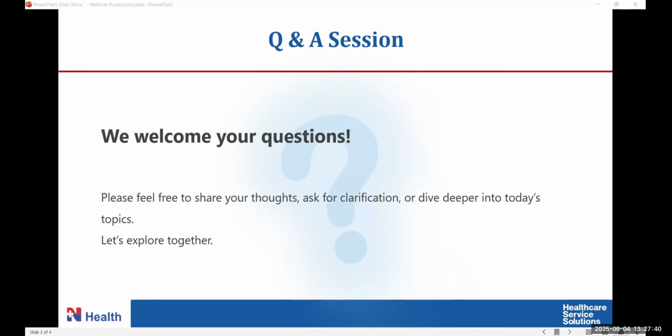That's my interpretation. Thank you, Professor. And let's move to the next question. It's about case 6. The participant asks, what is the difference between apocrine mixed tumor and chondroid syringoma?